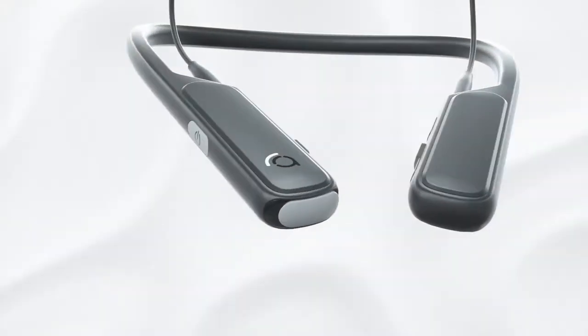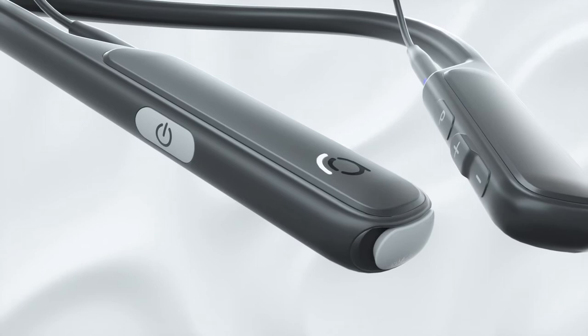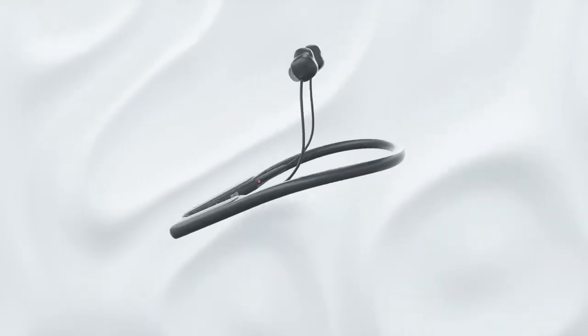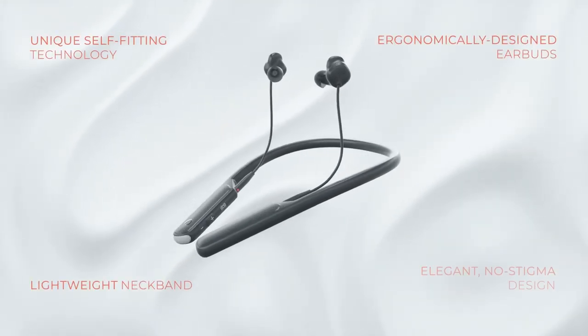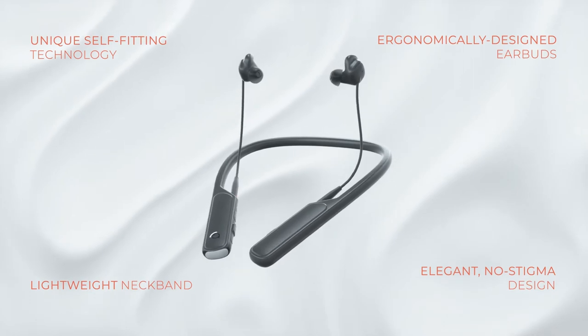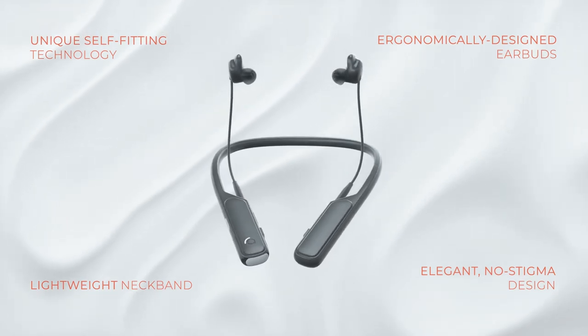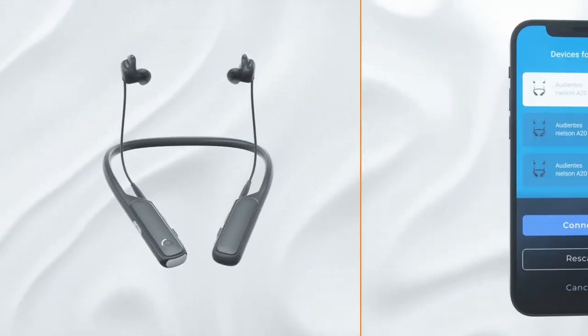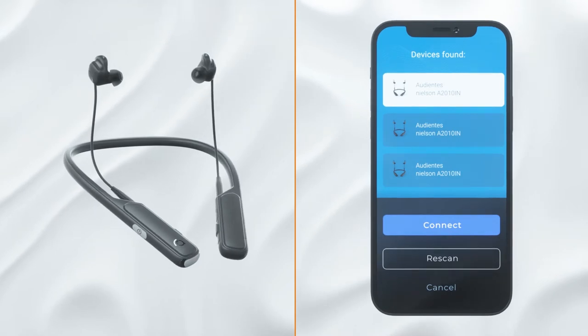The Audientis hearing aid is a smart, self-fitting, high-quality solution. Equipped with Audientis' innovative self-fitting technology, the aid can be controlled either by the on-device buttons or via a smartphone app.